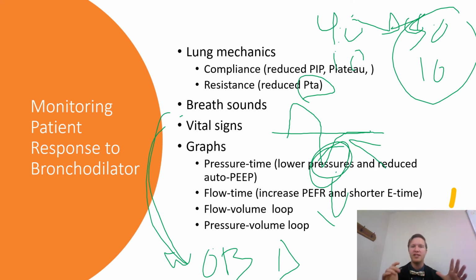So hopefully all these tell you, okay, giving a nebulizer or giving an MDI or giving any kind of medication to a patient, whether they're on non-invasive positive pressure ventilation or invasive positive pressure ventilation, has a lot of dynamics to it, right? What's best for your patient, right? So think about this. This patient needs good quality medication delivery, but they already have high airway pressures. Well, if they already have high airway pressures and they need good airway medication delivery, am I going to pick a small volume neb? No. I might pick a vibrating mesh nebulizer.